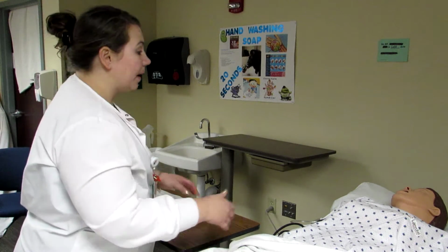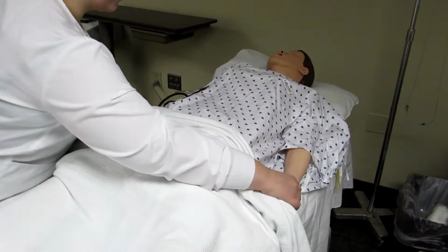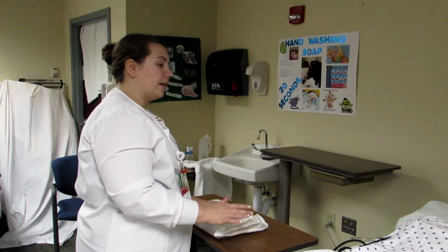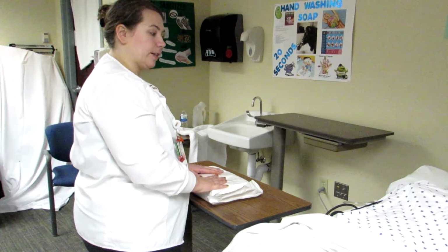I'm going to check your ID band to make sure that you're really Mrs. Smith. Can you tell me your name and date of birth? Excellent. First, I'm going to take a few minutes just to get my Foley catheter set up. I'm going to clean your perineal area. Make sure you're nice and clean before we insert this to decrease the chance of infection.